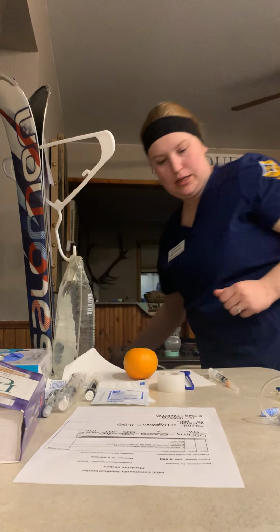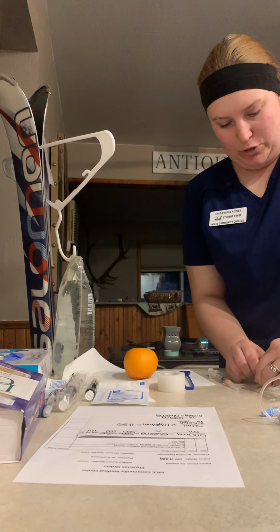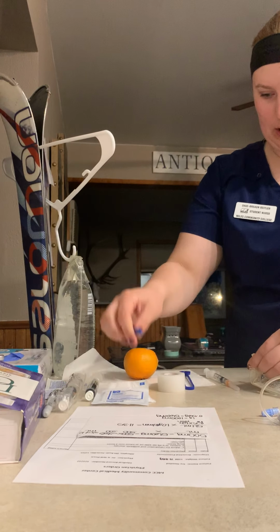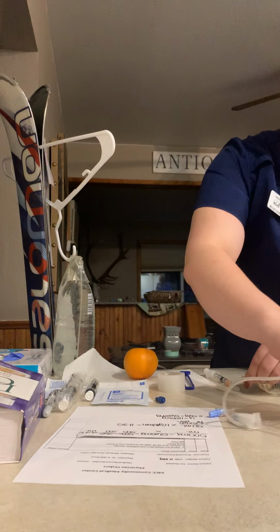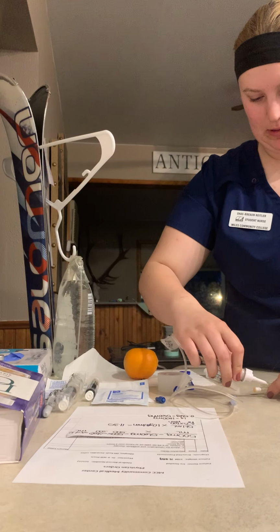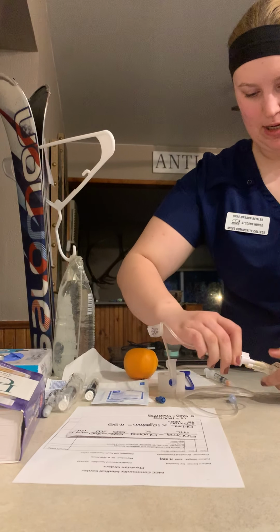Okay, now we can open the port to the piggyback. Oh, whoops, wrong one. Well, I'll put this on. Maintaining sterility with this spike here. Make sure you puncture the inside there.